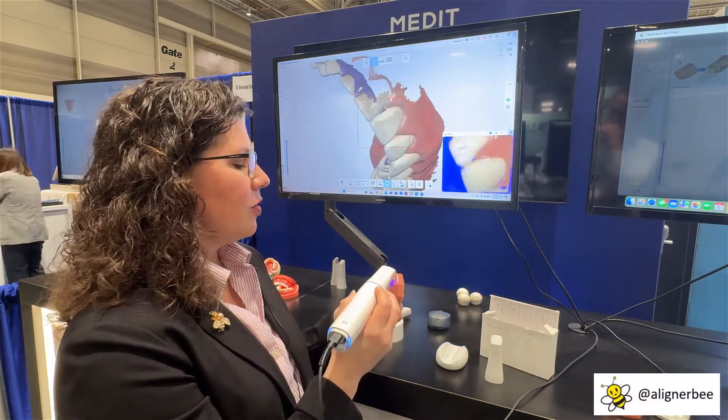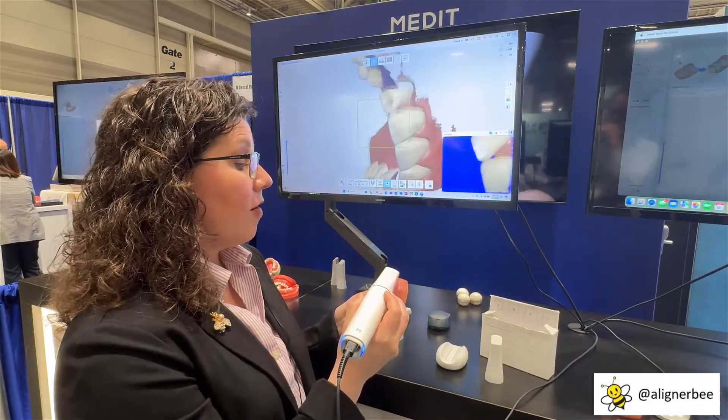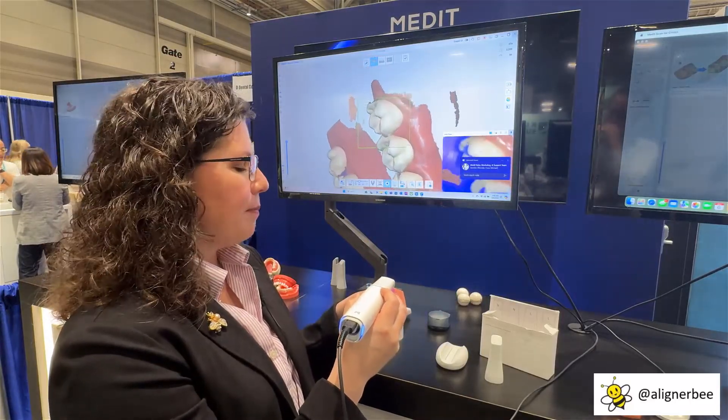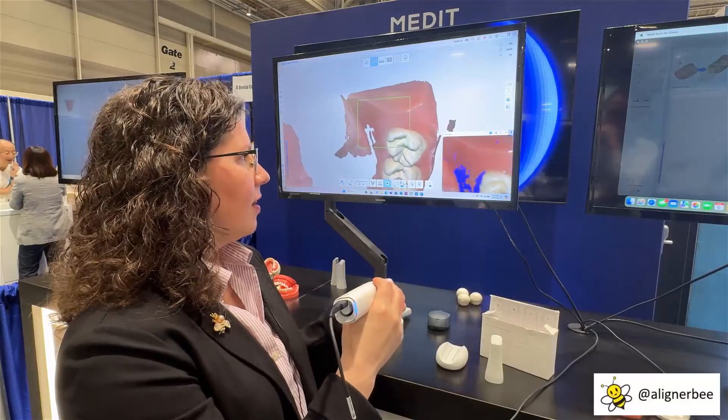We're able to continue to capture the teeth. With this scanner, you can use a hover pattern above the teeth when scanning, so you don't have to tap the teeth and roll along them, which some patients find uncomfortable.